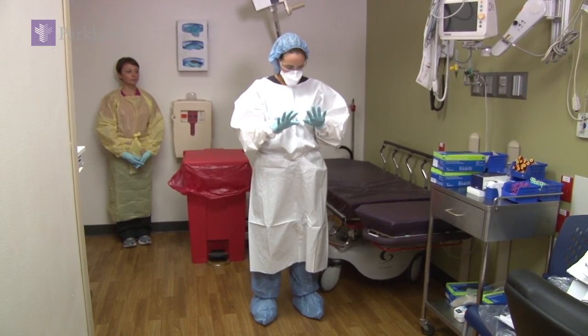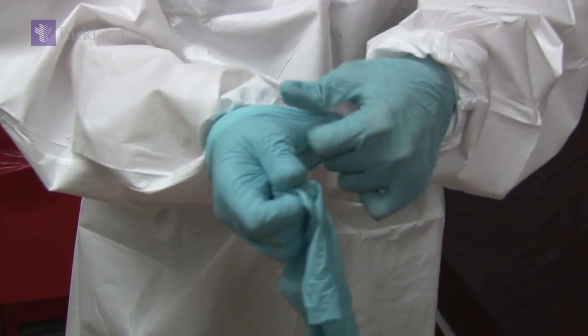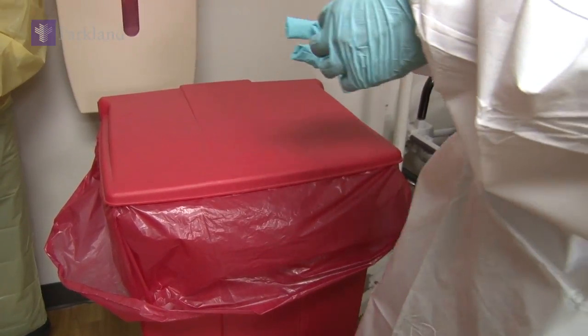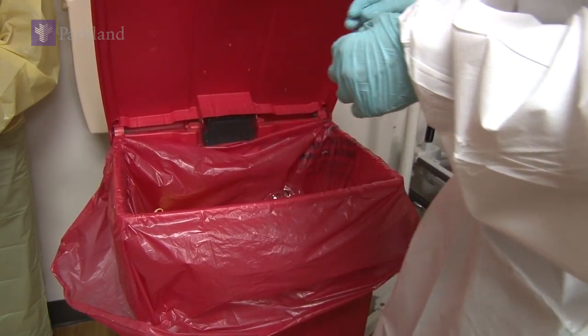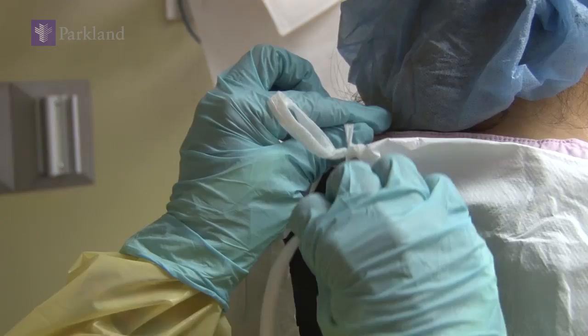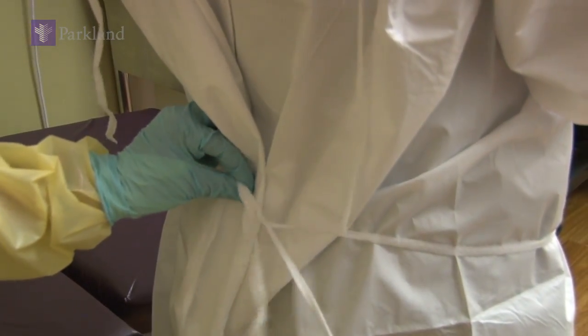Begin by removing only your outer pair of gloves. Leave the inner pair on for the next couple of steps of the removal process. Drop these gloves into a container lined with three biohazard bags. The trained observer will then assist you by untying the gown from your neck, followed by your waist.